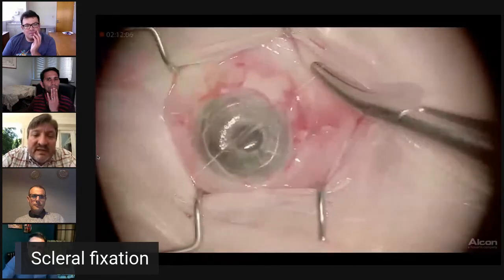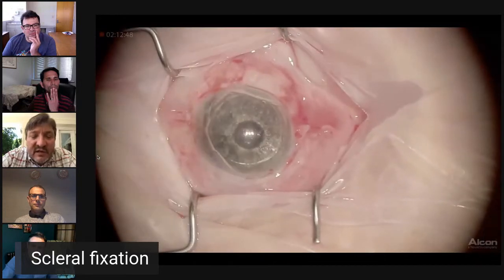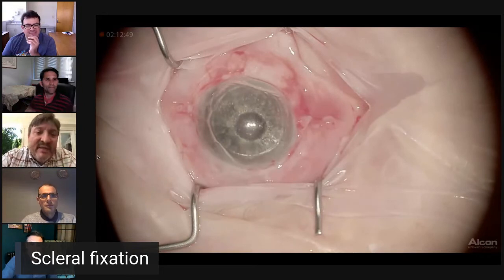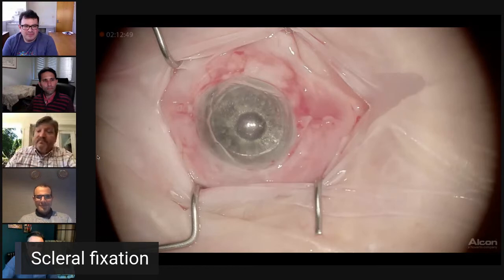Then we do a nice scleral depressed exam to make sure we didn't create any badness, close the conjunctiva, and this eye came back to 20/80, maybe a dirty 20/70 in this 90 plus year old man. So that was a huge victory. The cornea survived this surgery in terms of clarity, and he went on to do really well.